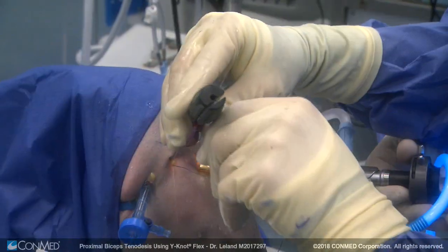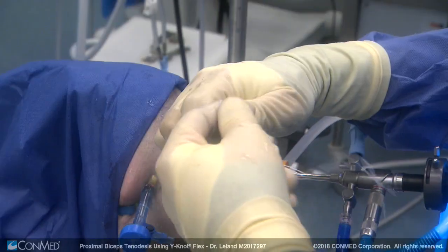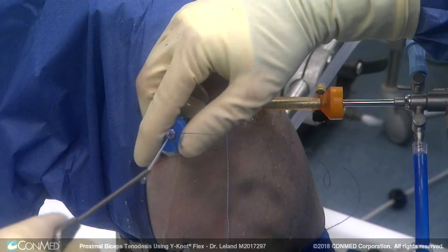The anchor is inserted, the sutures are taken off the handle, the inserter is removed, and the sutures are tensioned. Once tensioned appropriately, we use a ringed grasper to pull one of the limbs out through the anterior portal.